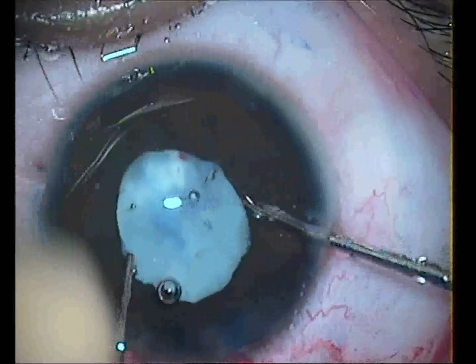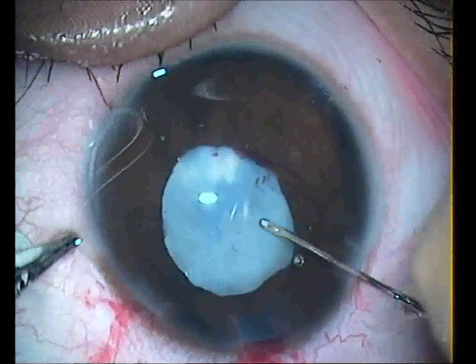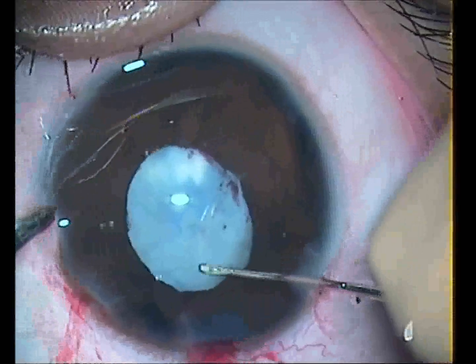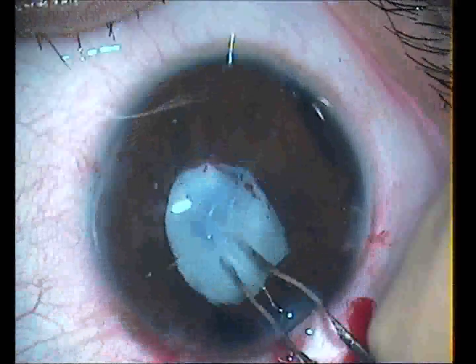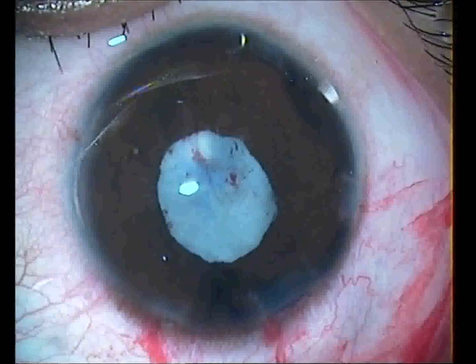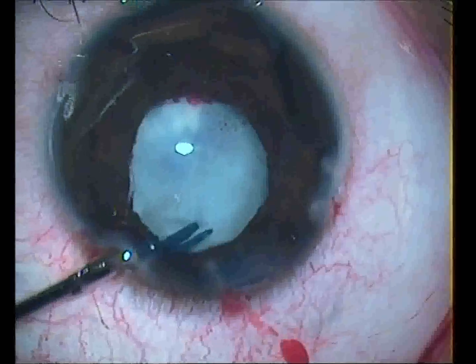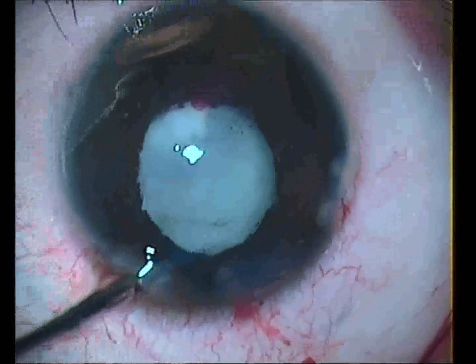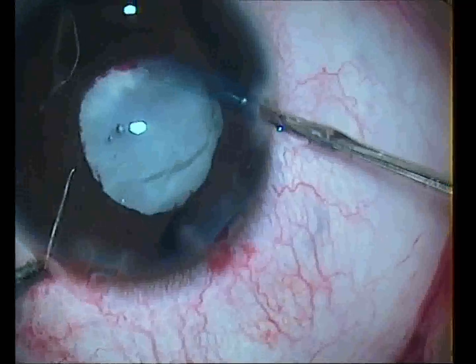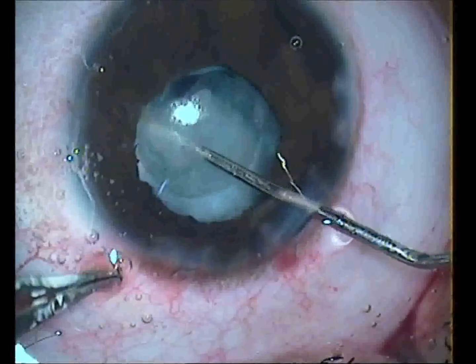And when I started doing capsular access, I found that the anterior capsule is very fibrous and not giving any entry for the capsular access. So this could be another challenge. So pierce this fibrous capsule with a 30 gauge needle or 26 gauge needle, and with the help of vitreous scissors you can cut the fibrous anterior capsule in a fashion so that it becomes like a circular rhexis kind of thing.